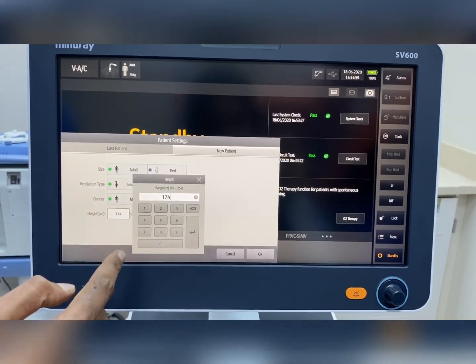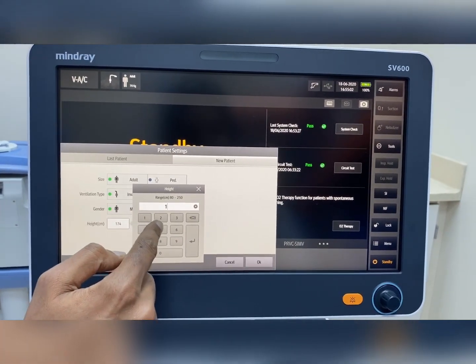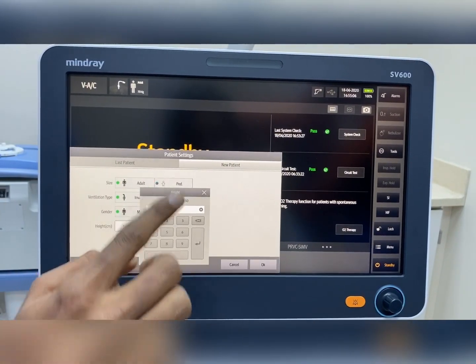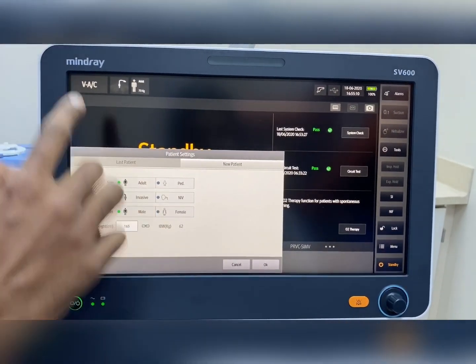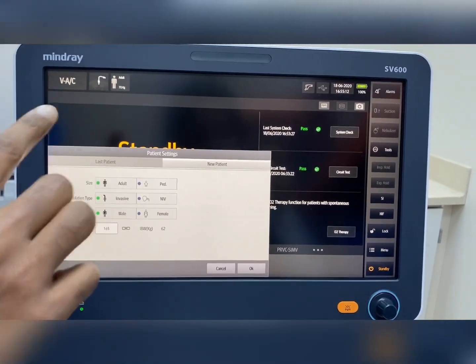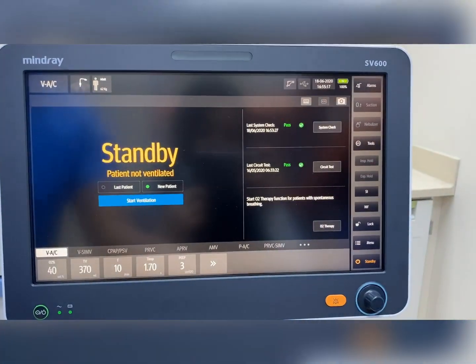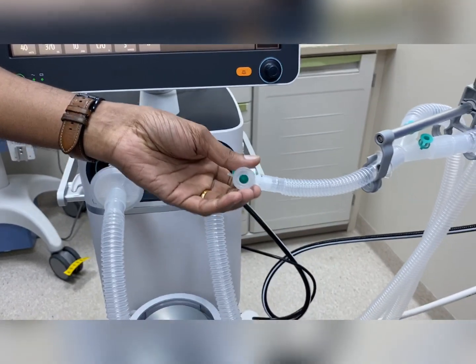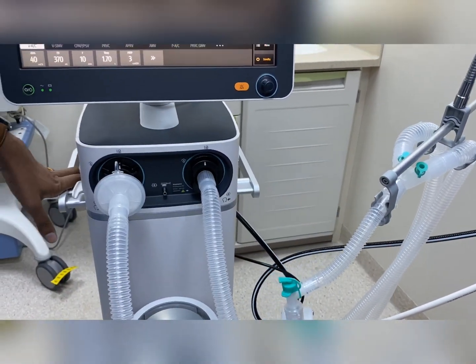Once the basic details are entered, you have to measure and enter the height of the patient. For example, I am putting 165 cm. With that input, the machine automatically calculates what the ideal body weight of the patient is. After this, you have to disconnect the patient and hook the machine to the test lung.